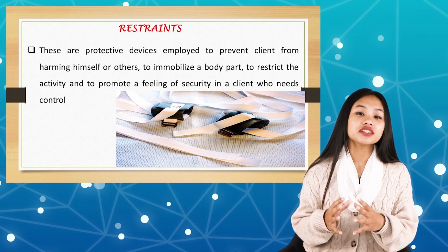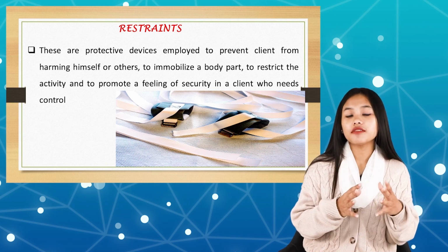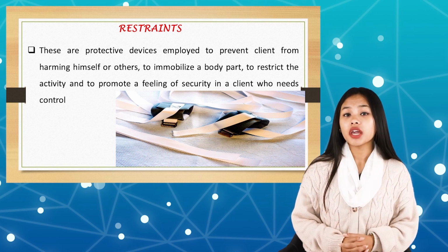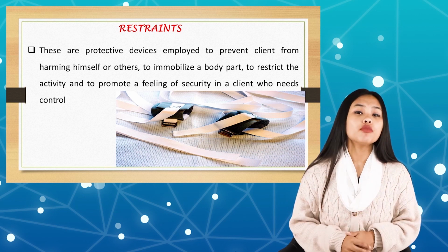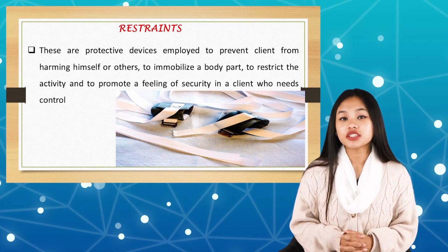These restraints are also used as a last resort. So these restraints are protective devices which are employed to prevent the client from harming themselves or from harming others, as well as to immobilize any area of the body that is required, to restrict the activity of the client, as well as to promote a feeling of security in a client who needs control.